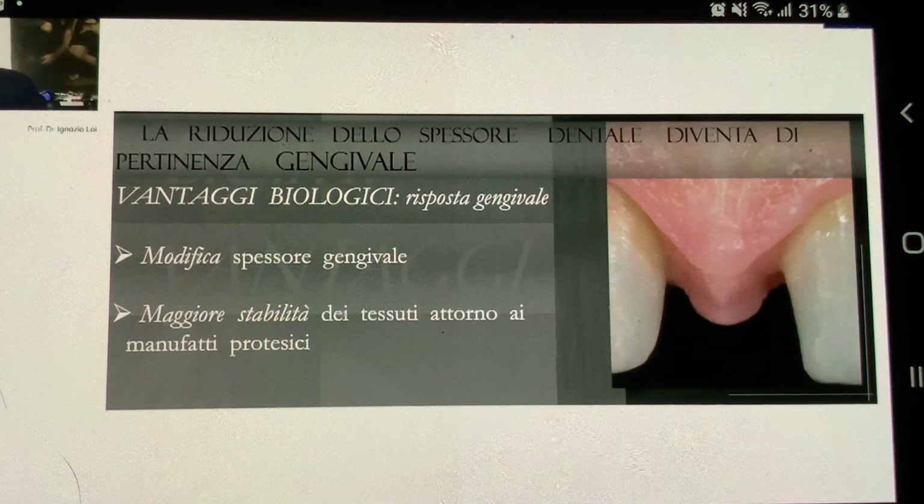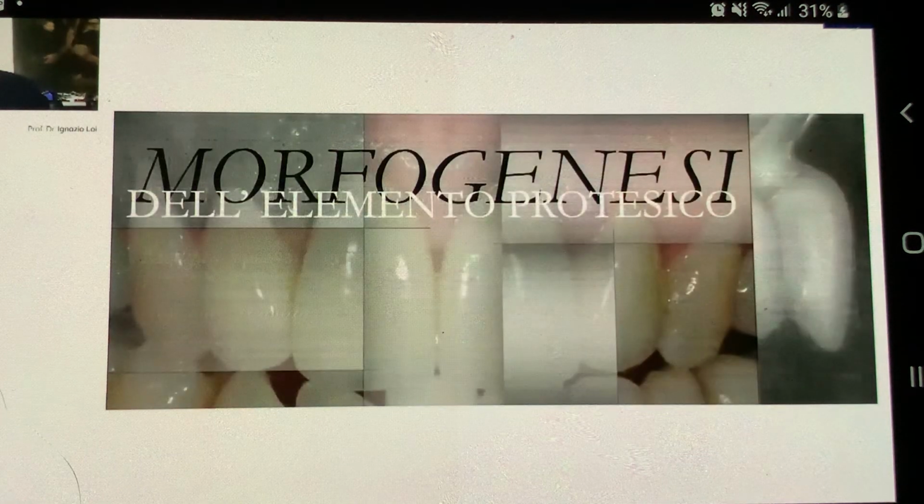The other great benefit is that the tooth preparation creates a space and becomes a part of the tissue. So when we prepare a tooth and we create spaces, then the gums will occupy those spaces, so it become thicker. So BOPT is a technique that changes the volumes and the thickness of the tissues. When I said that in the past, well, that was difficult, but now there is a whole series of clinic and scientific evidence corroborating this.